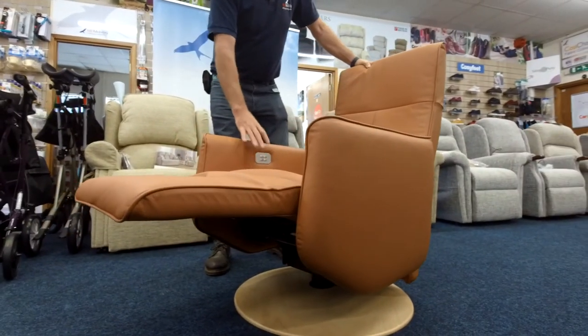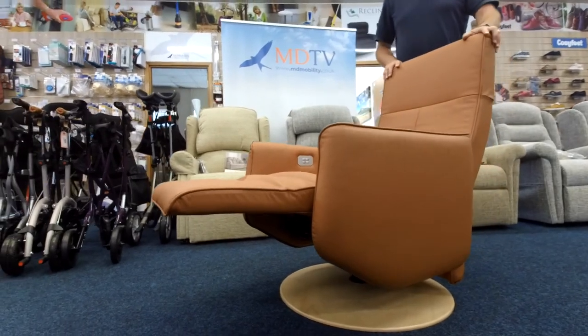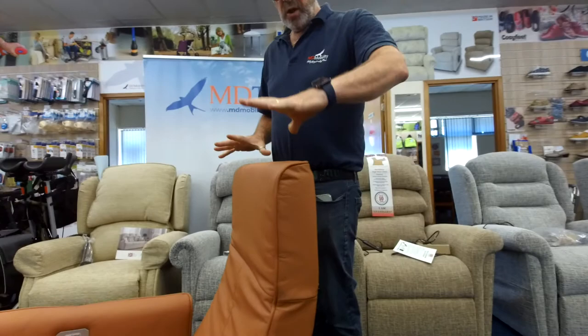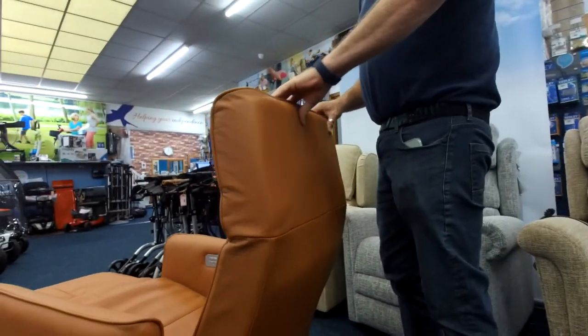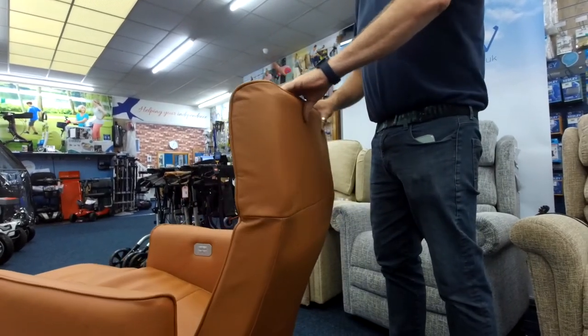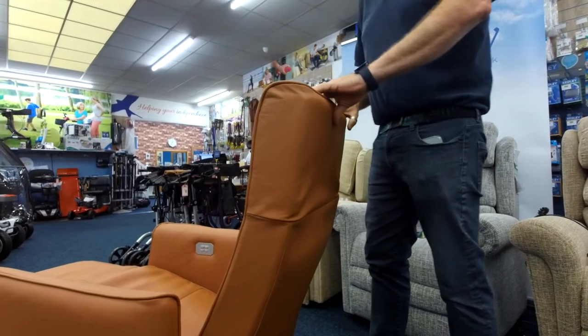And up your footrest goes. Now when you're in that position, if you want to move your headrest — built into the headrest up here is a mechanism where when you move it forward and let go, it automatically locks in whichever position you put it. If you go right the way forward it goes right the way back, so you can lock it and have it pretty much anywhere you need it.